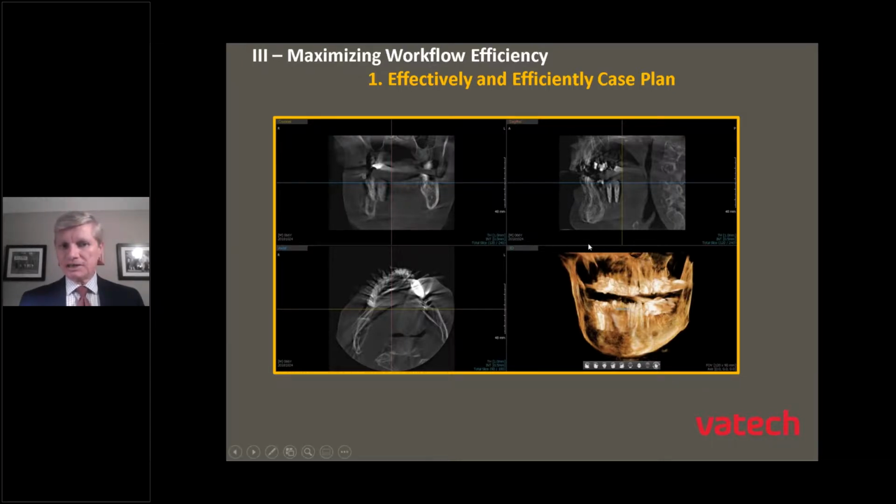Just a quick identification: when you're looking at a CBCT scan and I'm seeing what looks like a ghosting effect, where I see two cortical plates, the buccal cortical wall right there in the mandible, that's certainly a clear indication. When I see what looks like a streaking effect going on throughout the CBCT scan, that's also a clear indication the patient moved during the scan itself.